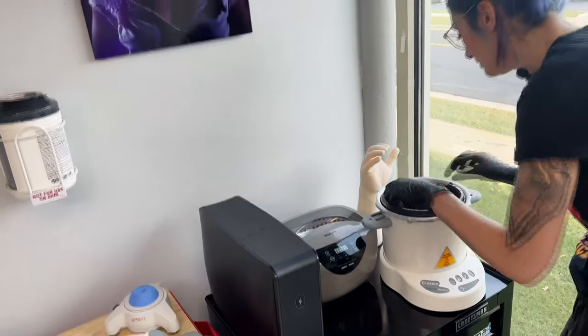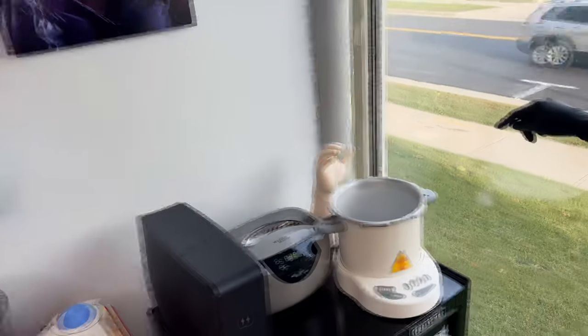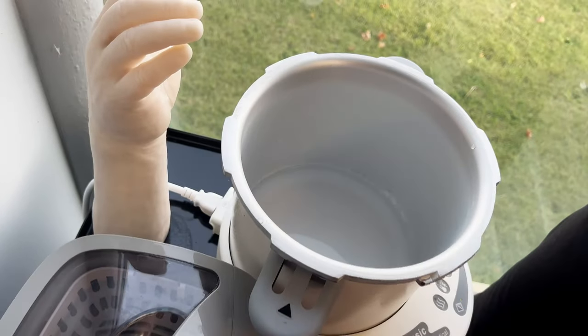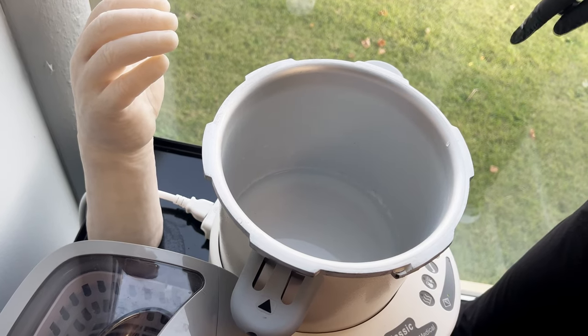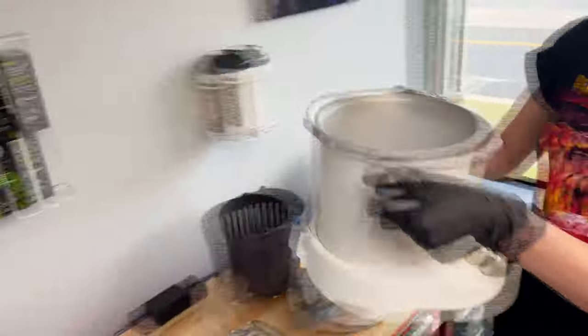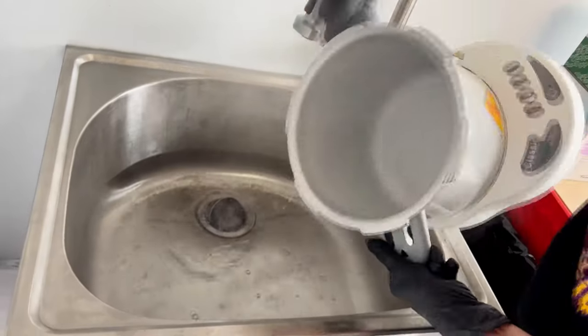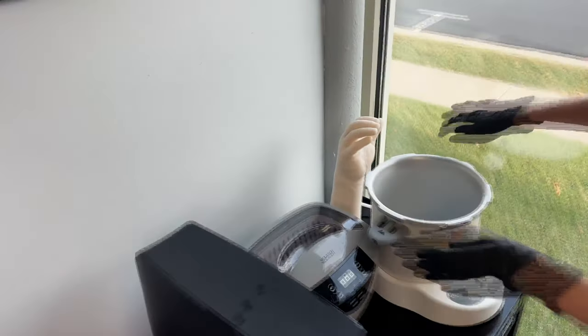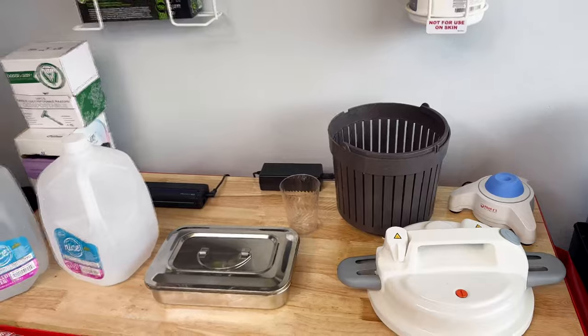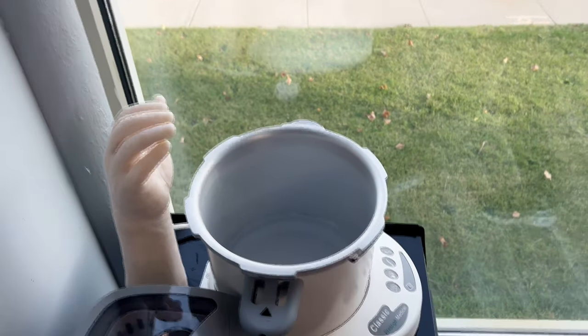I'm going to set the lid to the side and take the basket out. Because it's plugged in, I'm going to have to unplug it to dump out this water — you want to dump out the water after you run the Chamber Bright cleaner. Careful, it's hot. Then I'll get some more distilled water and get us back to the water line.